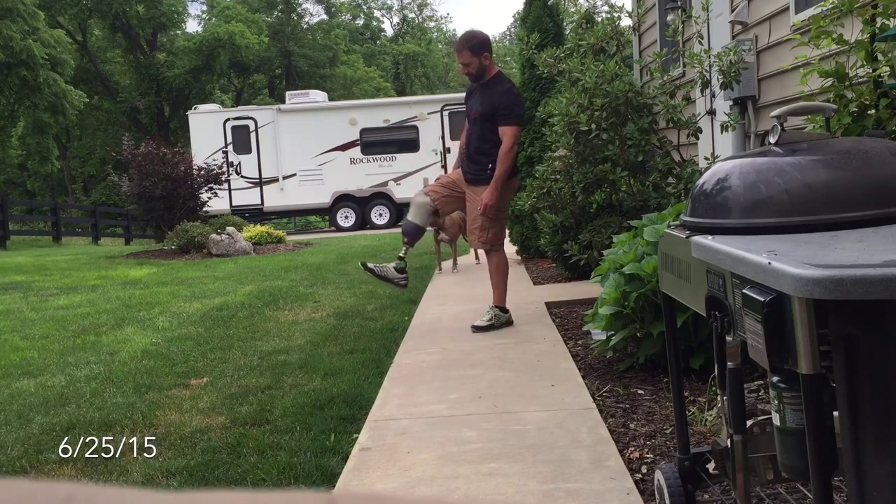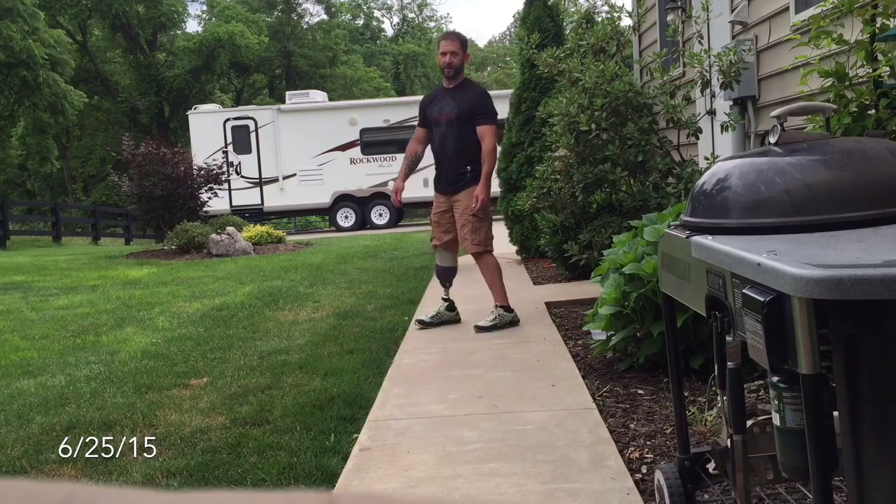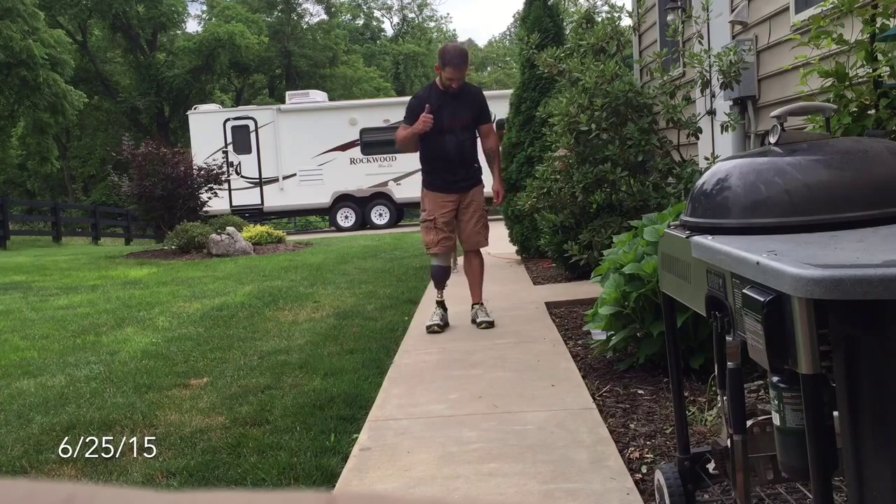Before, with that big bulky one, I was probably only out to about there. So we're in good shape — ready to rock.